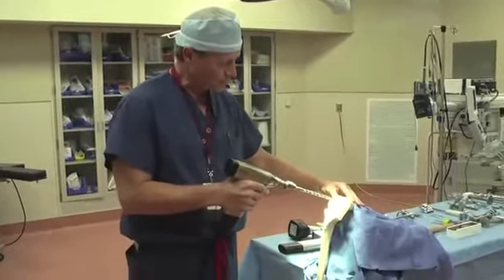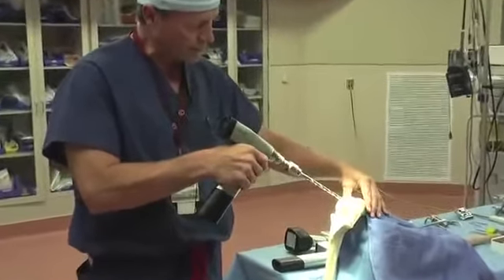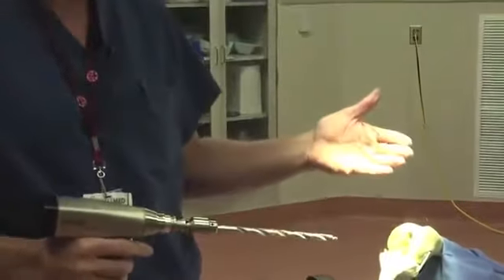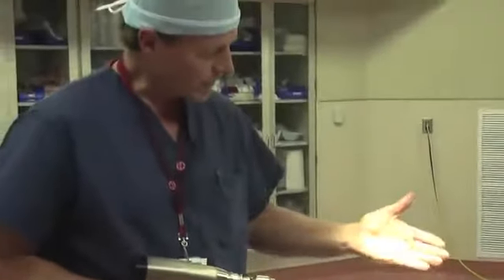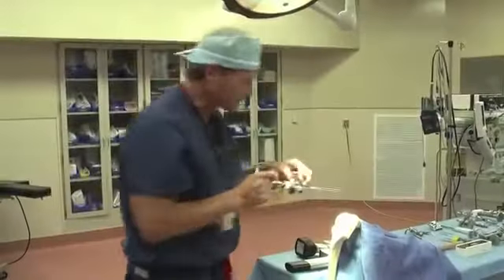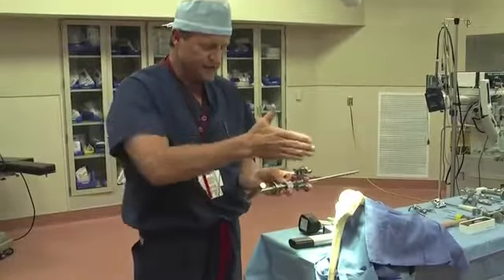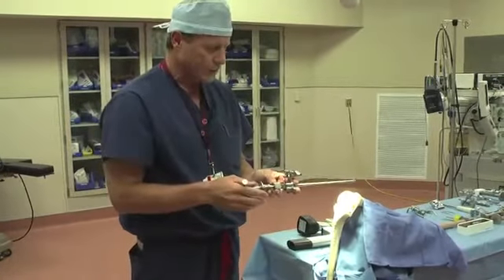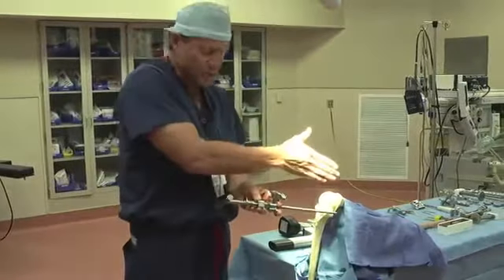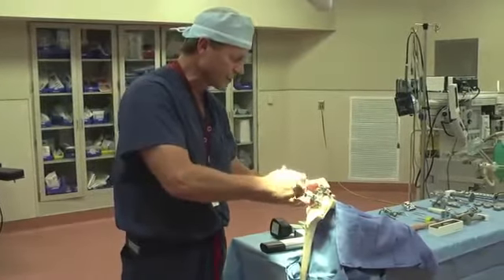We'll next use a drill to make a little pilot hole into the end of the femur, and we'll actually drill that down into the femoral canal. The reason we do that is that we need a guide to give us our alignment when we put that first jig on. We'll place in this alignment rod, which has a cutting block attached to it, and it sets the angle for our cut. Normally we're going to set a five-degree cut on this distal femur unless something dictates that we do different.